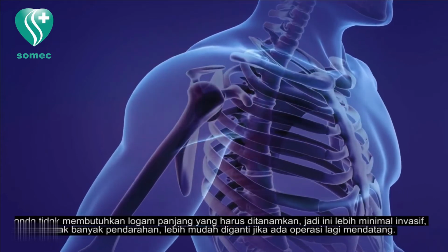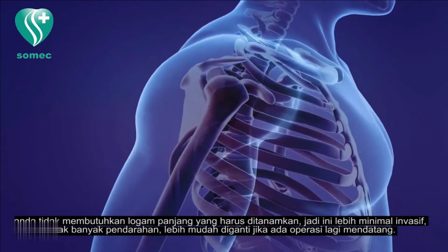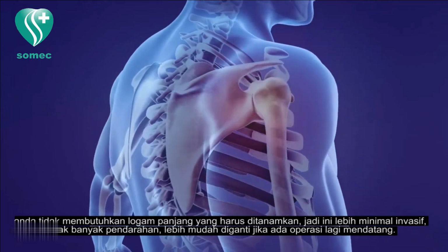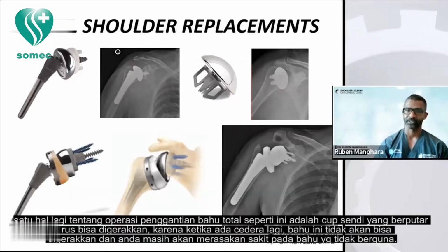So you can see you don't need such a long metal implant going in. So this is more minimally invasive, less blood loss, easier for revision procedures next time. But the thing with this kind of shoulder replacement is that the rotator cuff muscles must work. If the rotator muscles are torn, or if they get an injury next time, then it won't be able to work and you'll still have a painful, non-functioning shoulder.